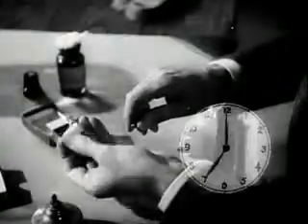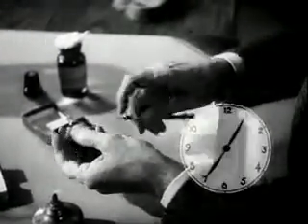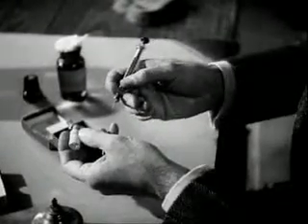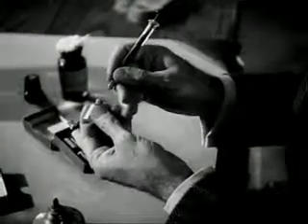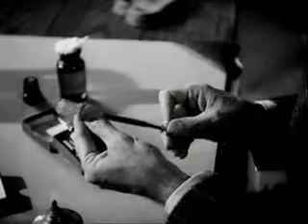Dissolve the tablet. Withdraw 1/10 of a cubic centimeter into the syringe.